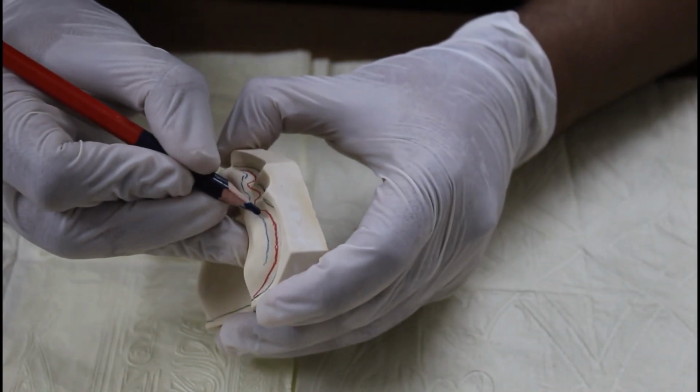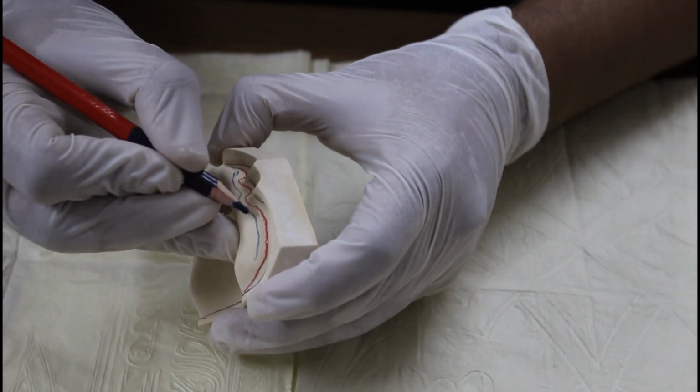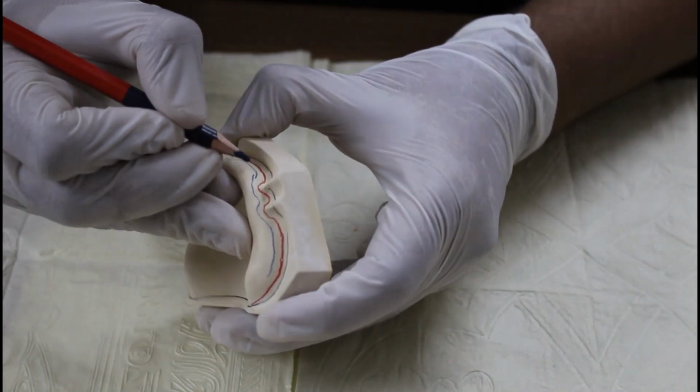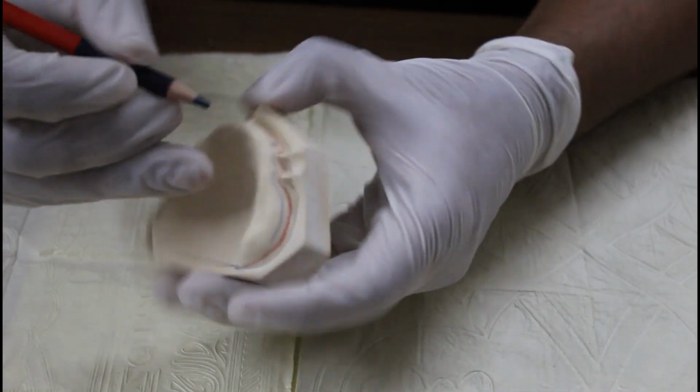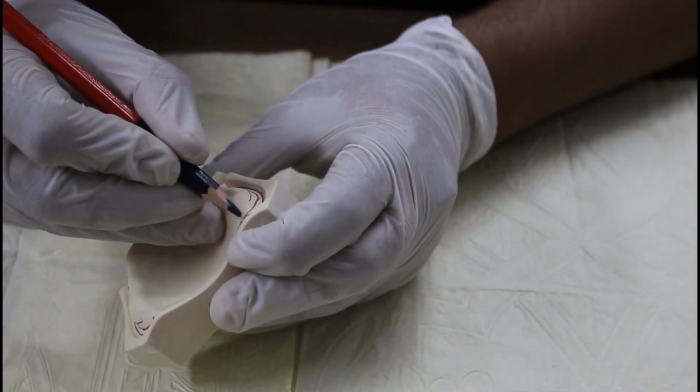See this? If the frenum is going up, the second line is going up and the third line is also going up. So we maintain 2 millimeter distance, and at the back it will not merge with the other lines.